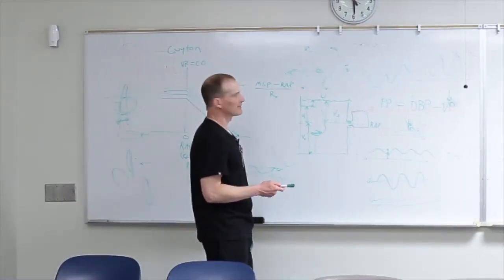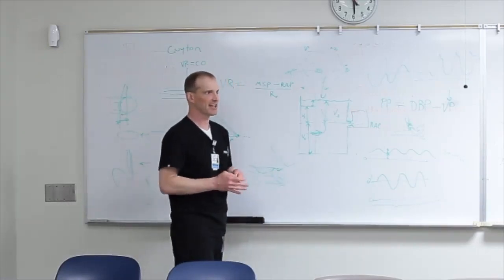Okay, we covered the portal vein. So then let's do some scanning.